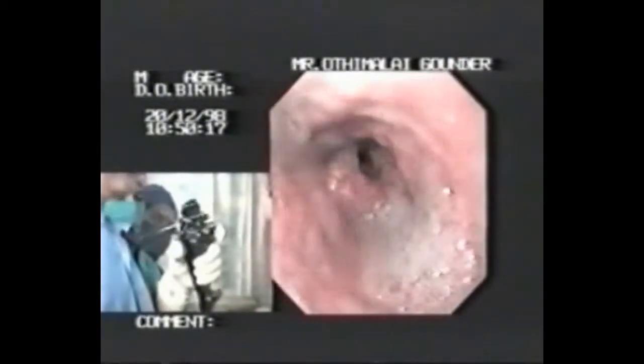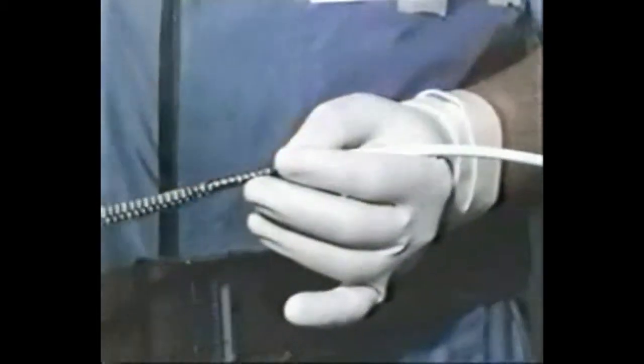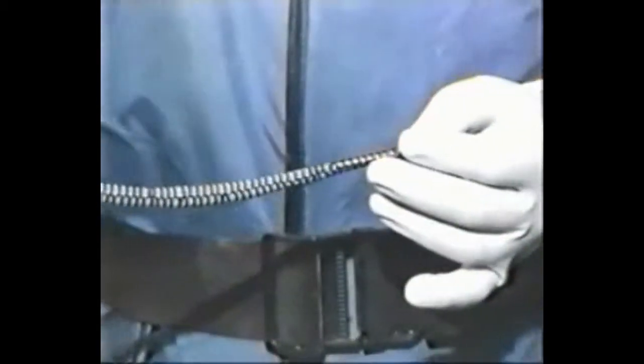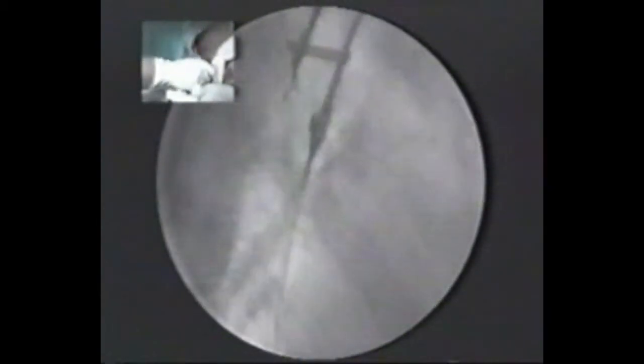Palliation in a case of malignant esophageal obstruction can be done comfortably by placing a self-expanding metallic stent. Under radiological control, the loading catheter is pushed across the stricture, which is delineated externally by the radiopaque markers.